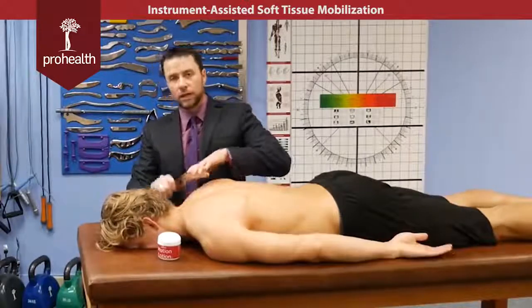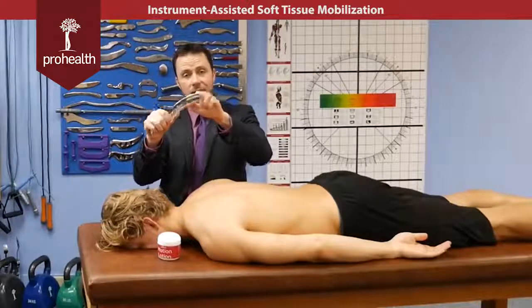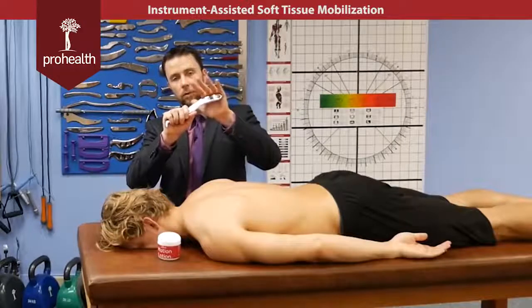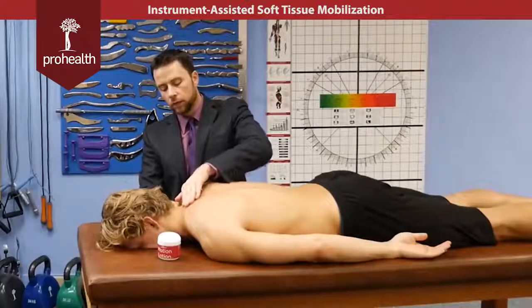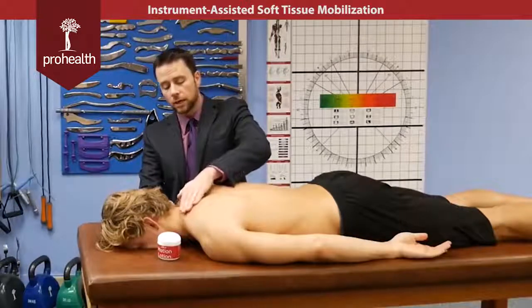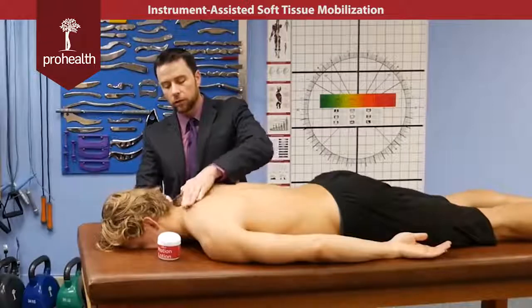A couple of things to realize, biomechanically, this is an easy action for me to perform. Your strongest action is actually pulling in like this, so if I put my hands over top, using my fingers or even the upper part of the palm of the hand, you can hook in and get a very specific contact and slowly scan through and see if you notice any tightness that you want to work on as a light superficial scan to begin with, and then you can increase the pressure and start to drag through that tissue and lengthen out the fibers.